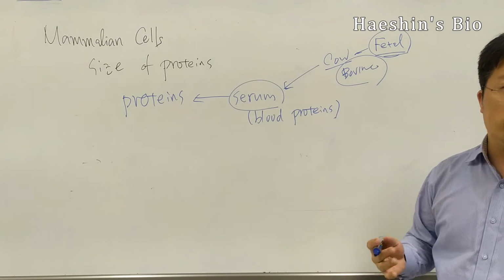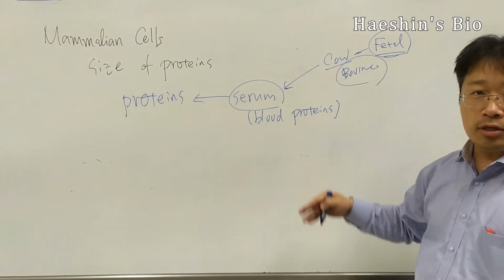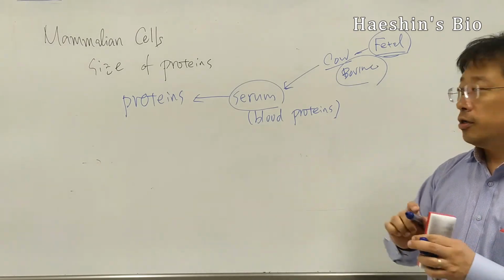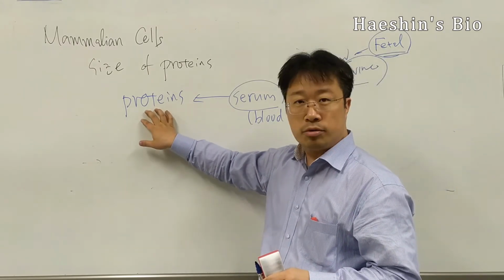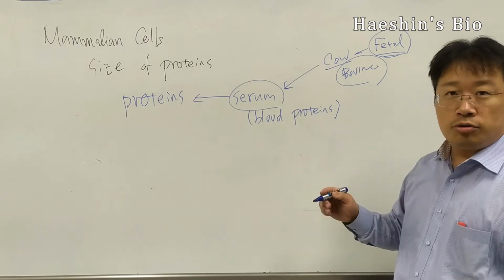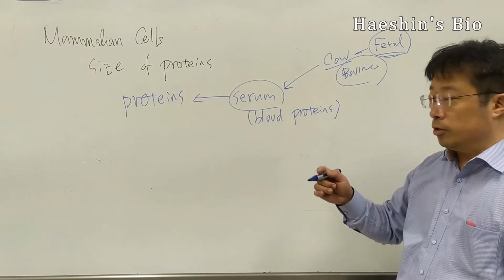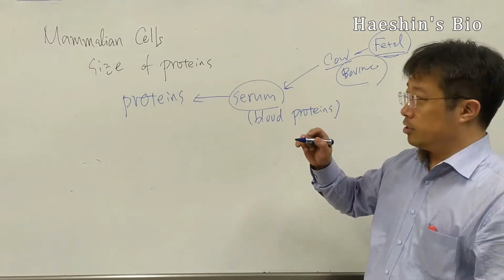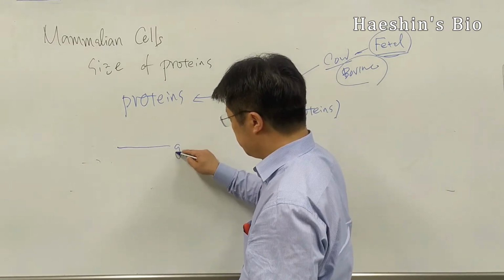This is a very cheap source, in a large amount. You take the protein with a very carefully controlled procedure. Then you get proteins from the blood, serum proteins, so you get solutions of the serum protein. I will show you in a moment, in a slide, that the serum looks yellow, and then you put a piece of glass.